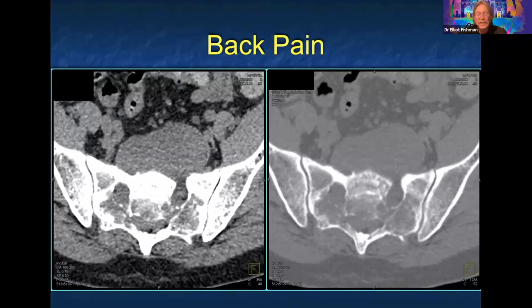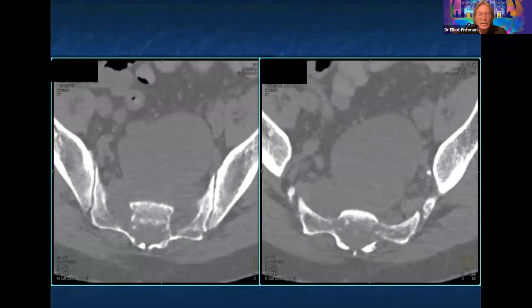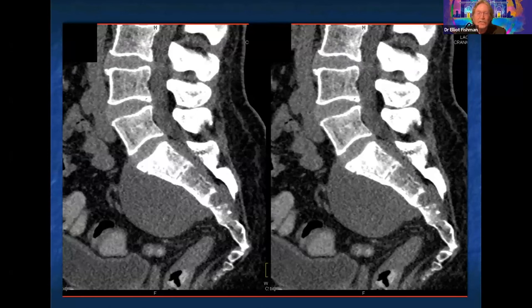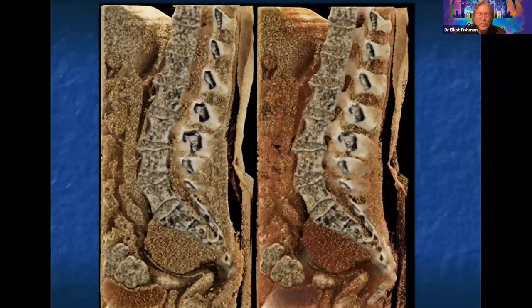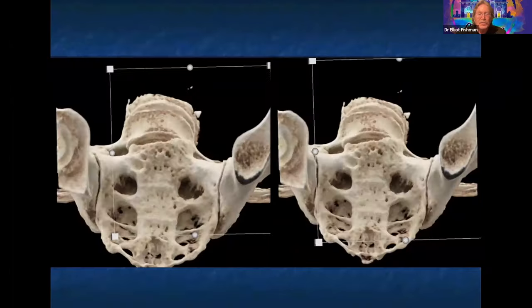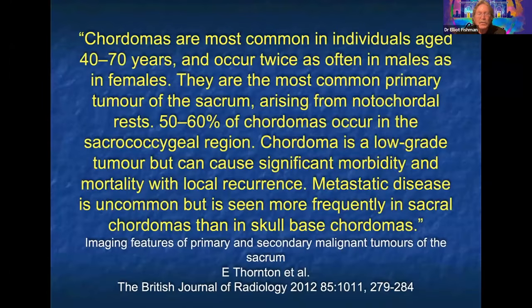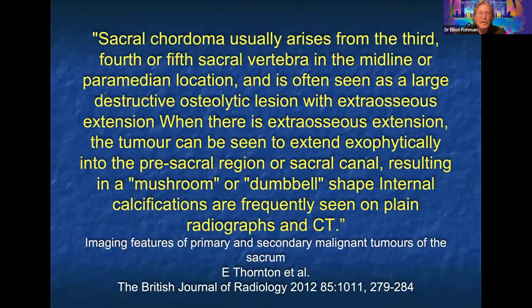Another patient — looks similar but not the same — back pain in a 60-year-old. A very classic location for chordoma: infiltrating, compared to the prior case of extramedullary hematopoiesis, this is a much more aggressive soft tissue mass with a much different appearance to the bone. Here it is nicely on cinematic rendering — you can see the infiltration of the bone. This was a chordoma. The pre-sacral region is really where we typically see it.